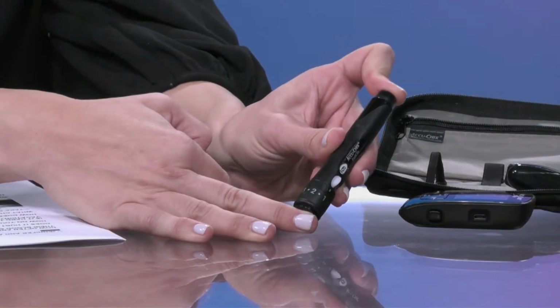As Amy can attest, and she's been doing this for quite some time, it's not painful at all. The amount of blood that a lot of these systems require is quite minimal now relative to what it used to be at one time. Jennifer, how often do you have to be checking your blood? How many times a day? What is the range that you are looking for? What's that key number?